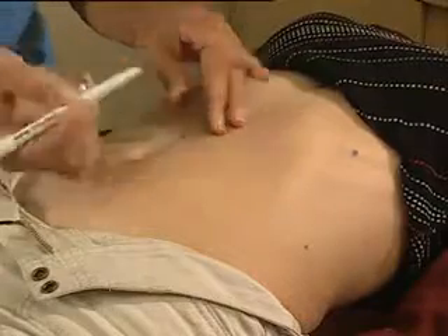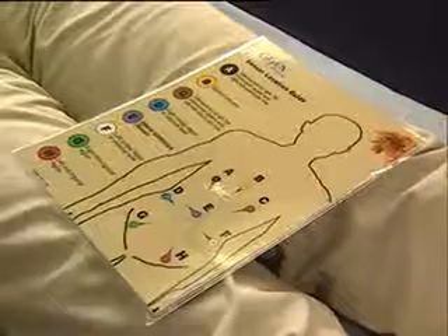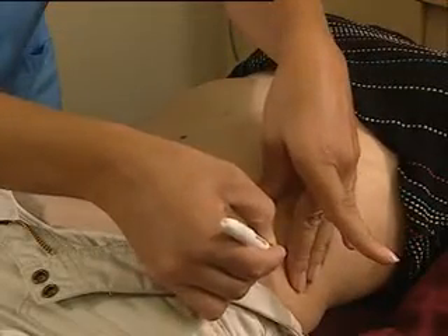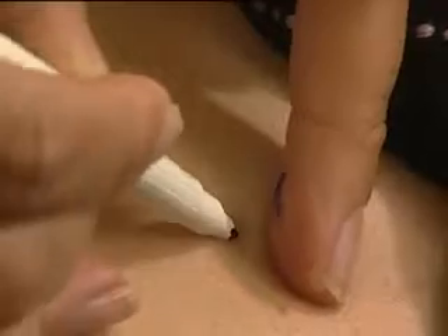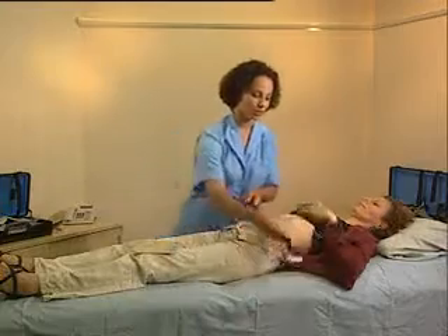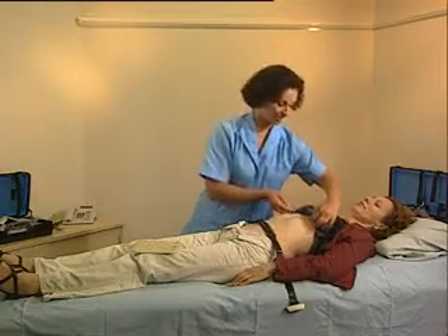Take care not to place sensors in inguinal folds or areas that may cause equipment damage. Adjustments may be required based on the patient's anatomy or surgical history, such as the presence of an ostomy pouch. Lay the sensor array on the patient's body, making sure the sensor array connector is at the correct position.